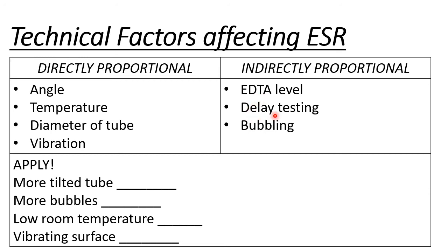Delay testing naman, napabayaan mo, no? More than siguro 2 hours, nadidislodge yung rouleau formation, pumapangit yung, or hindi nagiging accurate yung ESR natin. Okay? So, bumabagsak as you delay the testing. Presence of the bubbles. Okay? Bubbling. The more bubbles, the lesser your ESR.